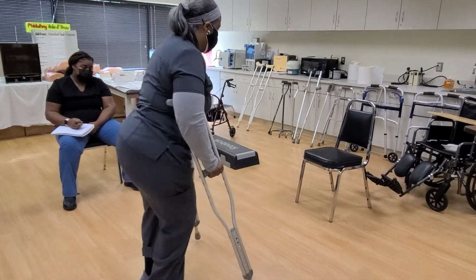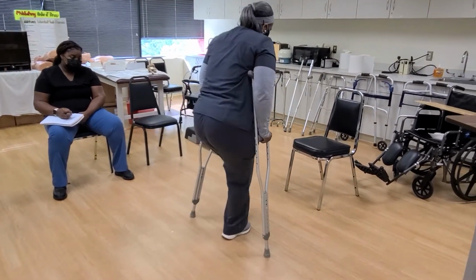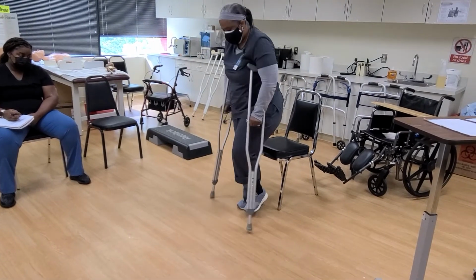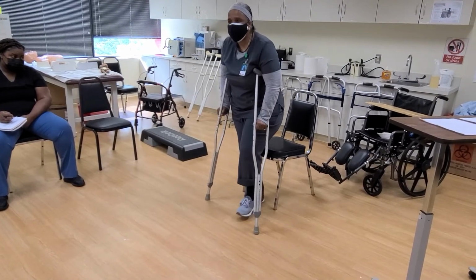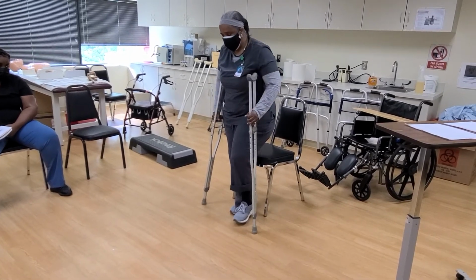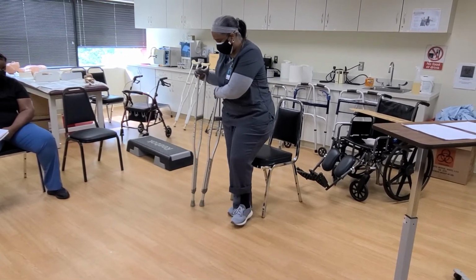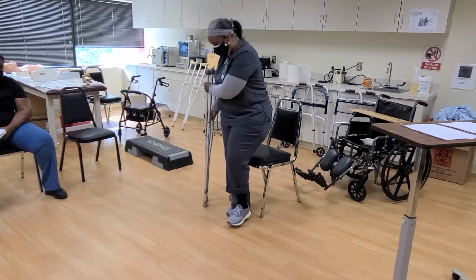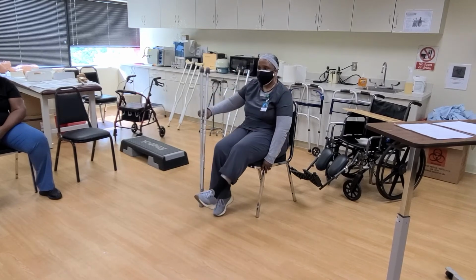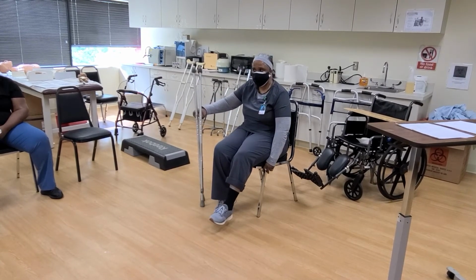Now, what if I'm sitting down? What I'm going to do is go towards my seat, turn around like this, and back up until I feel my leg touch the chair. Then I'm going to bring my crutch to this side and put them together. If I had a handle, if I don't, just hold the other side and sit down like that, okay?